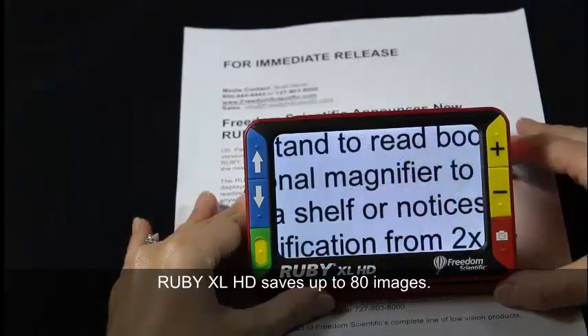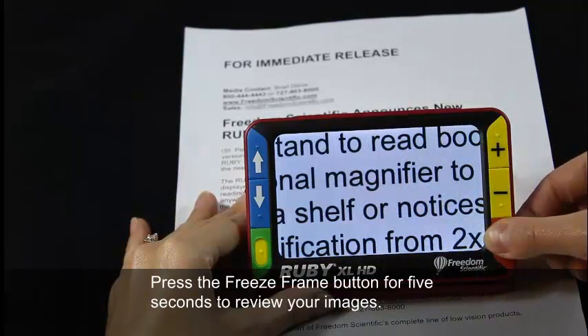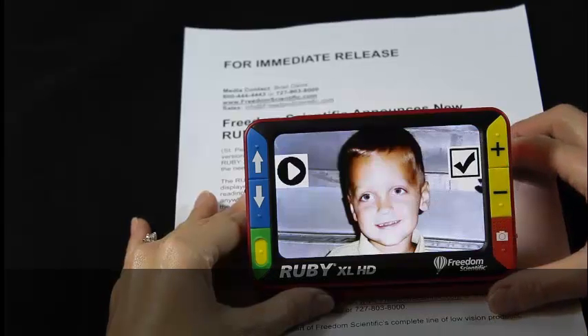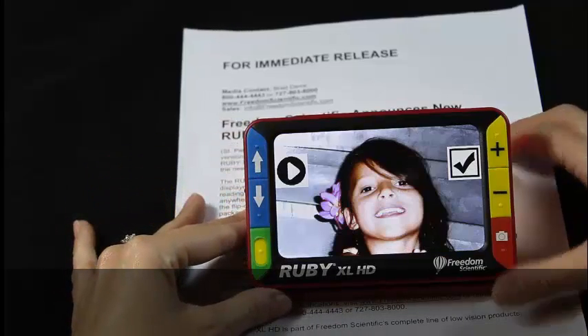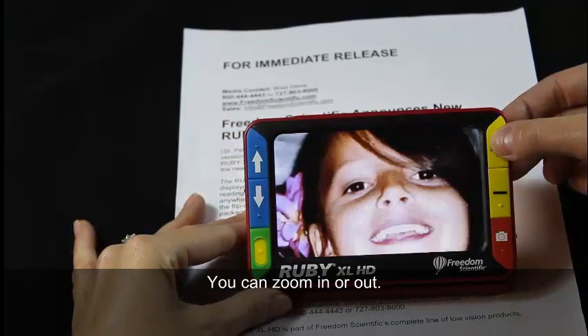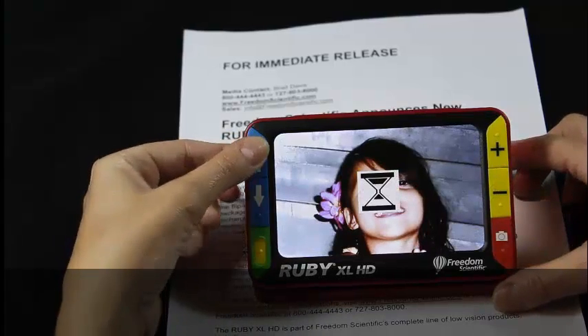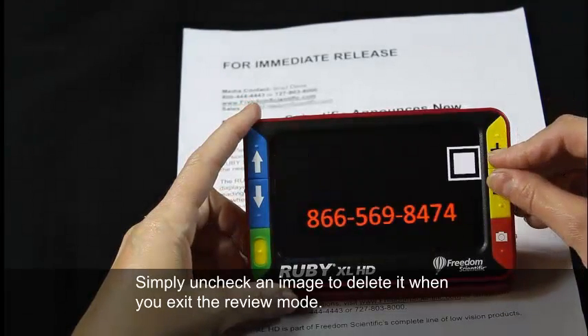Ruby XL HD saves up to 80 images. Press the freeze frame button for 5 seconds to review your images. You can zoom in or out, and simply uncheck an image to delete it when you exit the review mode.